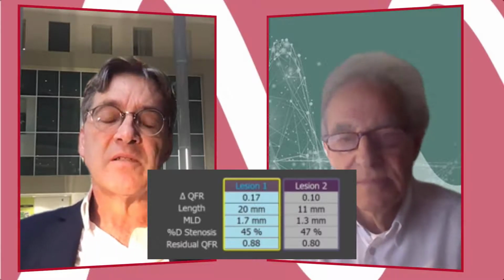But overall, the decision was made that it would be a better outcome, it would look better as well. But probably the right outcome would be to stent the whole segment and make it a really good visual and functional result, with the numbers you just mentioned.